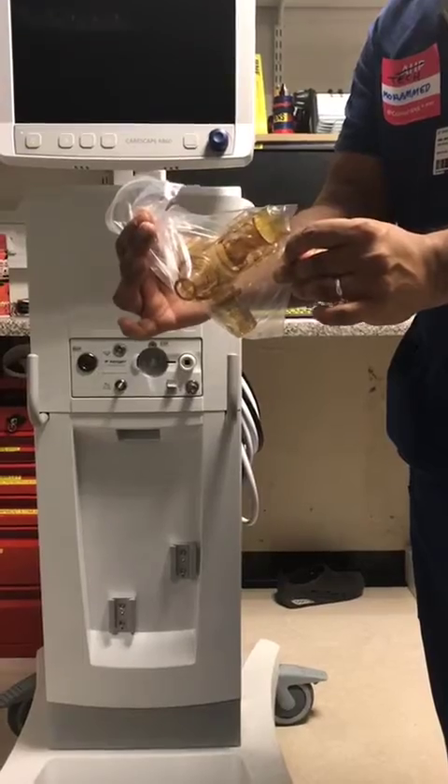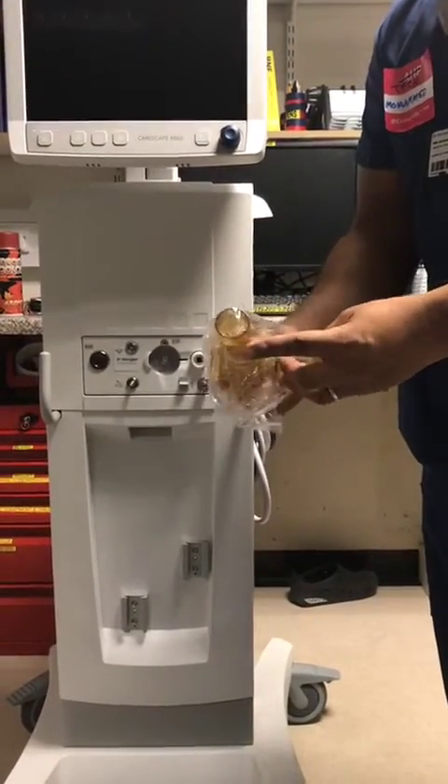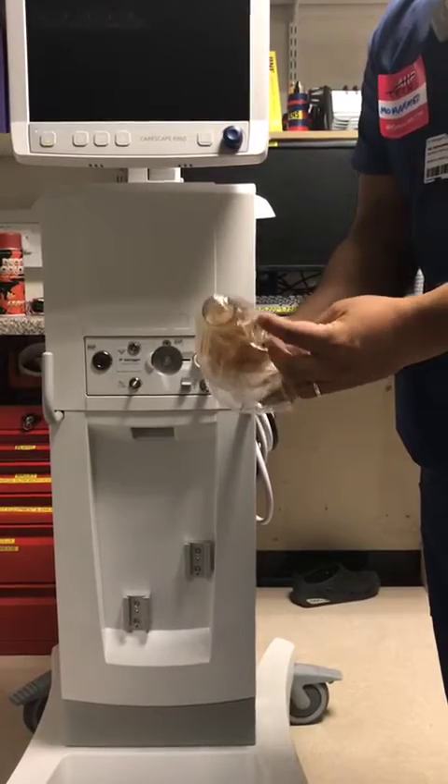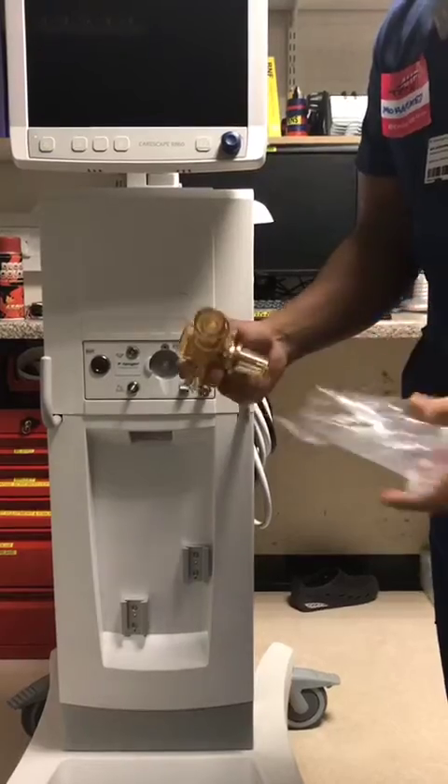You'll get a new valve in a packet like so. You open it up. This will be provided by the technician, who will leave it in a certain area in whichever ITU you work in. You take it out.